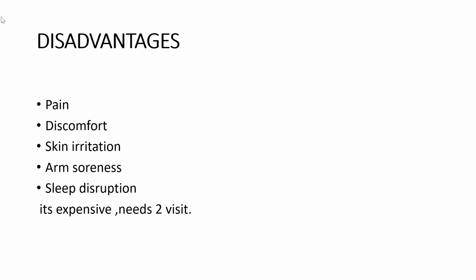Then for PVC burden, I saw that a PVC burden of more than 10% is clinically significant, and these patients are at risk of PVC-induced cardiomyopathy. So I checked for SVT, but I did not see it. I don't know if it's the same.